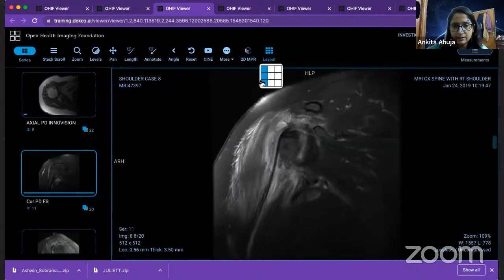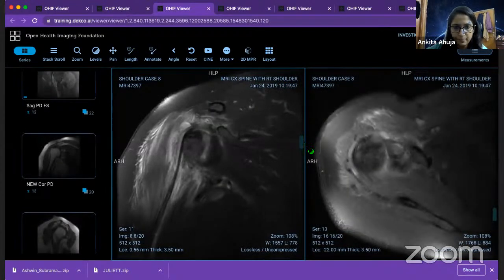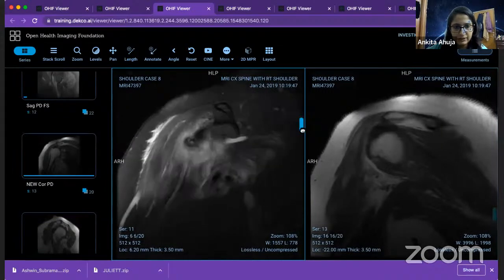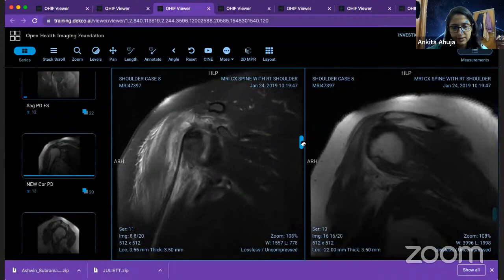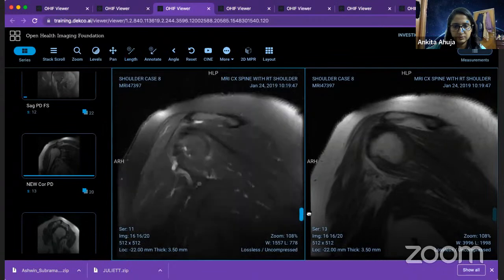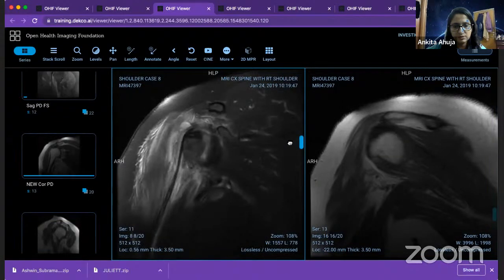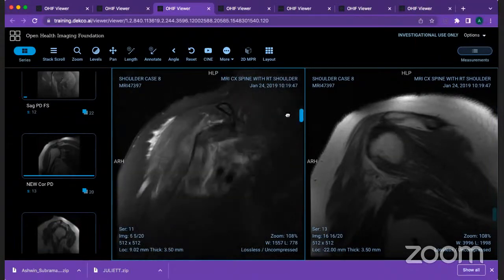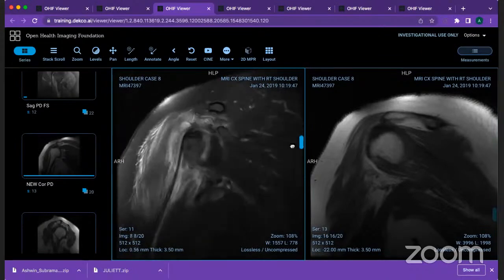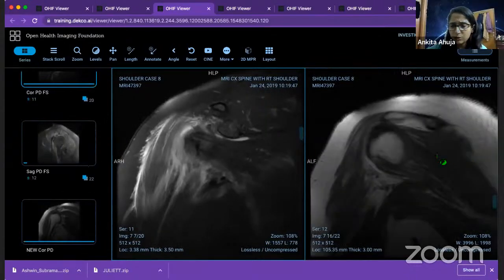Again, an interesting case. Let me know what you think. I'll just scroll on the images for you. Coracoid process, I am anterior, heading back. What do you see? Any abnormality? Some diffuse muscular edema in the deltoid, ma'am. Very good. So you see disproportionate lot of muscle edema.